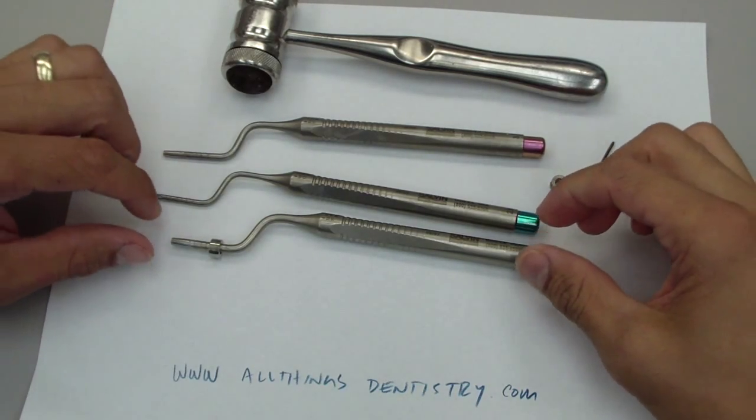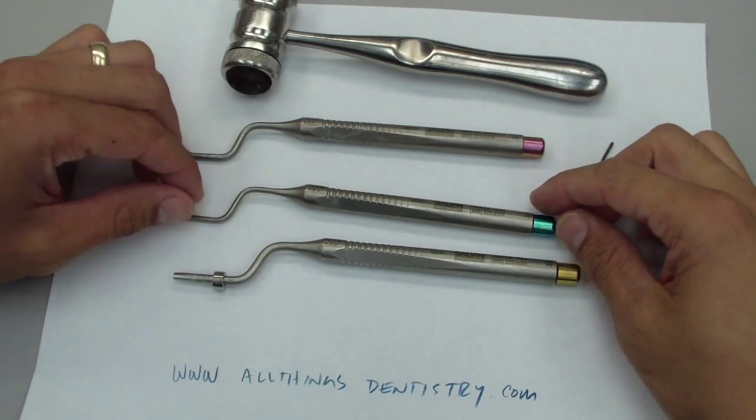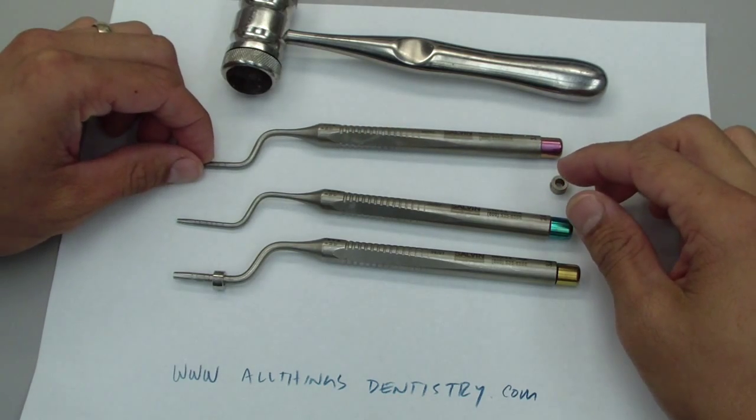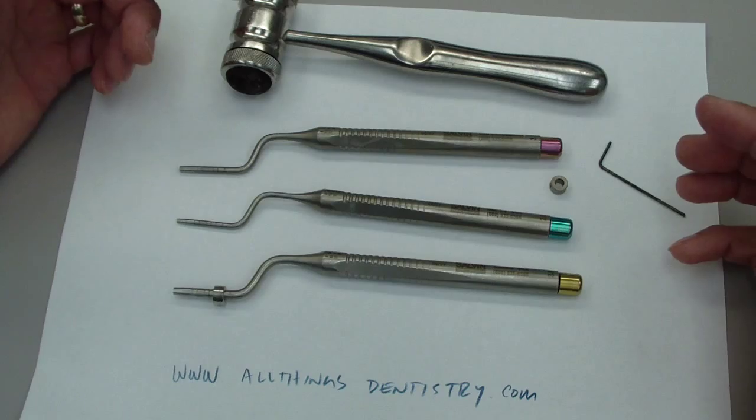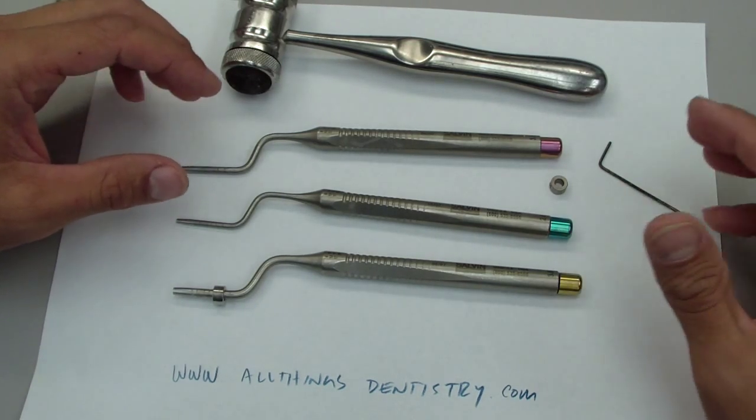Hey folks, Ashley here at AllThingsDentistry.com and I just wanted to briefly review these. They're called Offset because they're not straight in line with the handle. Osteotomes.